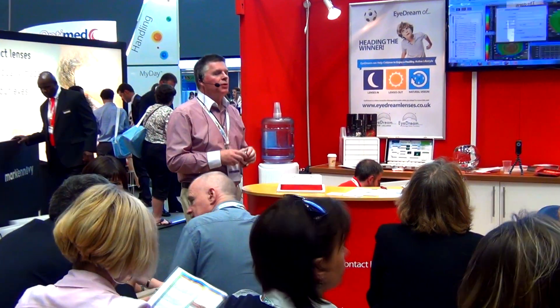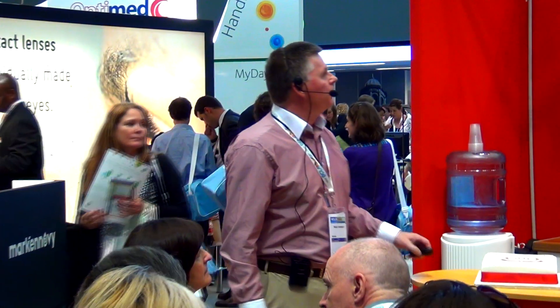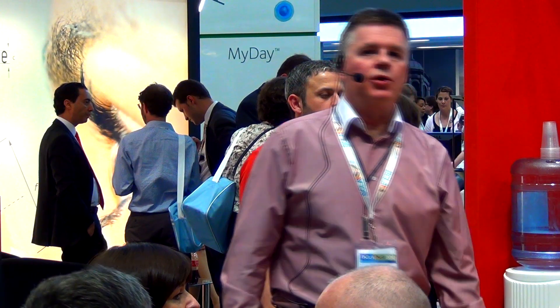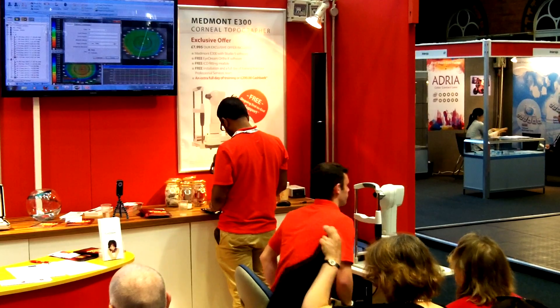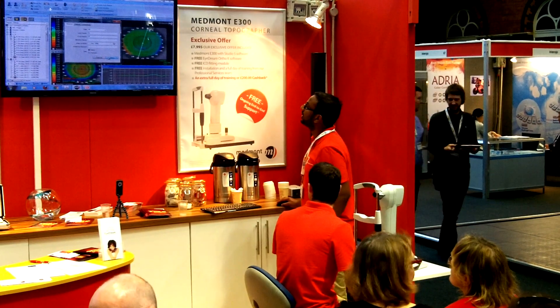What I'm going to talk about now is the practical application of topography in practice. We've got some images up on screen here, and we're going to take some pictures of Billy. We're going to show you just how easy, simple, and quick topography can be, and what an important tool this is in routine practice.